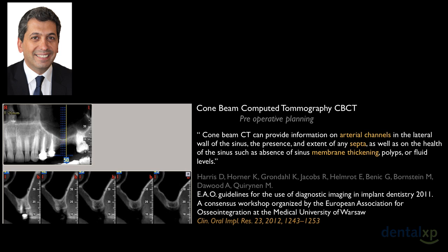Lately, the European Association of Osseointegration, in a consensus workshop that they organized, recommended the use of cone beam computed tomography each time we have to do a sinus floor elevation, in order to have information on arterial channels in the lateral wall of the sinus, and we will discuss it, the presence and extent of septa, and we will also see the importance of septa in sinus elevation, as well as the health of the sinus, such as absence of sinus membrane thickening, polyps, or fluid levels.